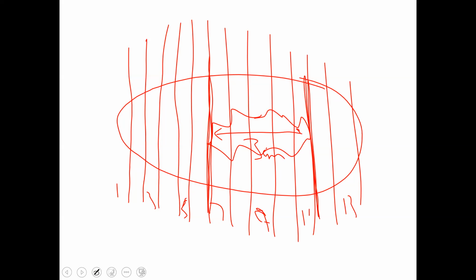That will allow us to correlate, because when you're sitting in breast sign out, I'll constantly say, okay, what slice are we in, and what slice was grossly tumor, and are these matching up? I regularly will ask you to tell me what slice we're in. Did that match where the tumor bed or the tumor was? Then we'll map along and confirm the size. So that's one important feature of determining size.